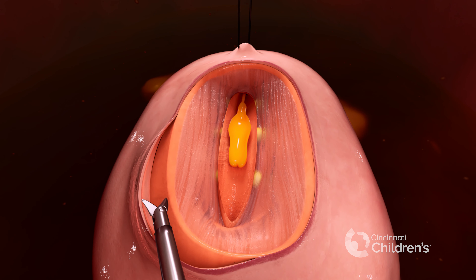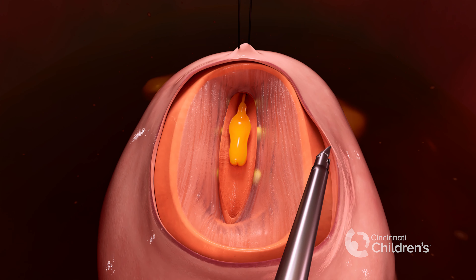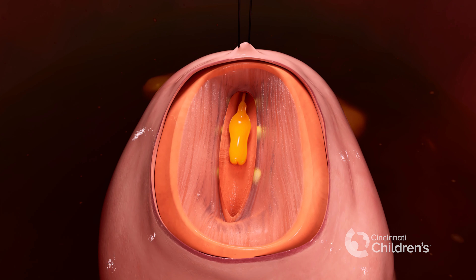We then raise the skin flap around the defect to loosen up the skin. This will eventually help us form a watertight closure of the spinal defect.